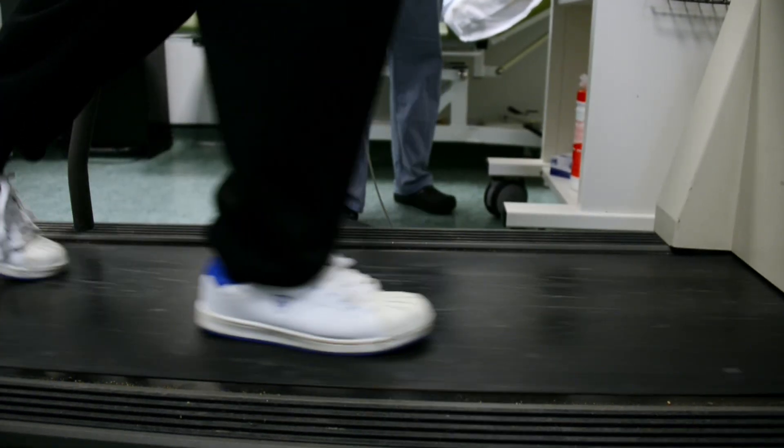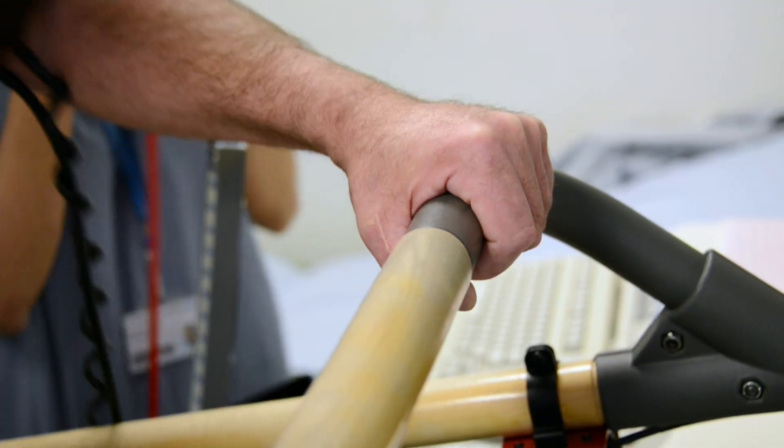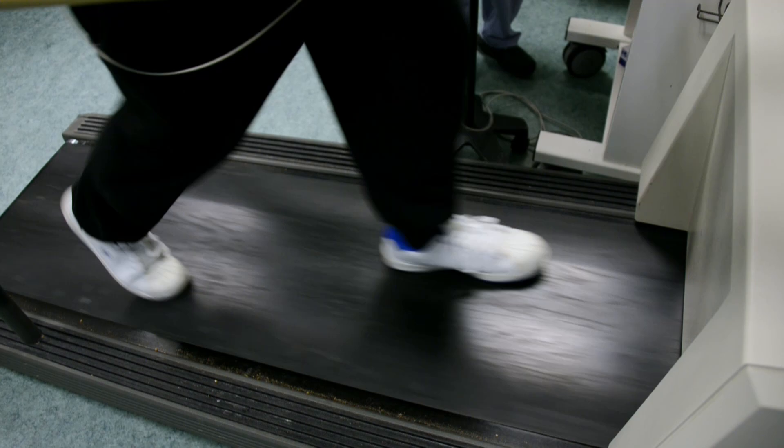We try and encourage the patient to do as much as they can, but obviously they need to tell us if they have any symptoms at all, and we'll also be monitoring the blood pressure, the heart rate and the ECG.